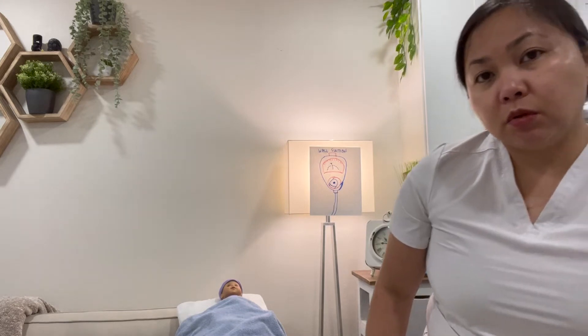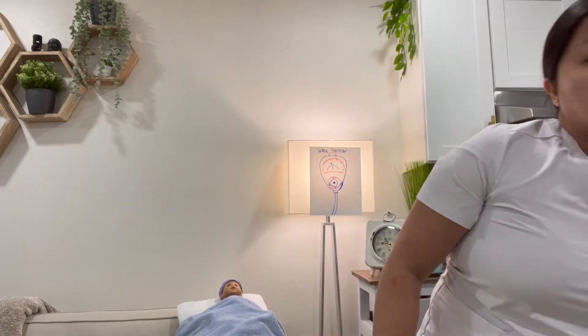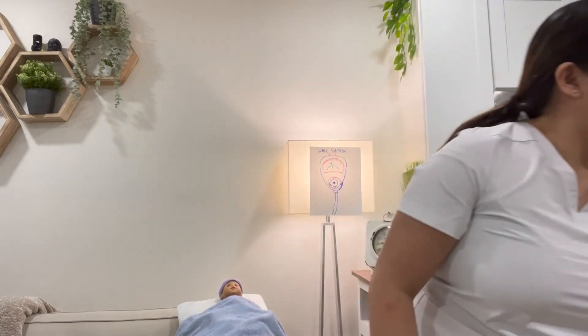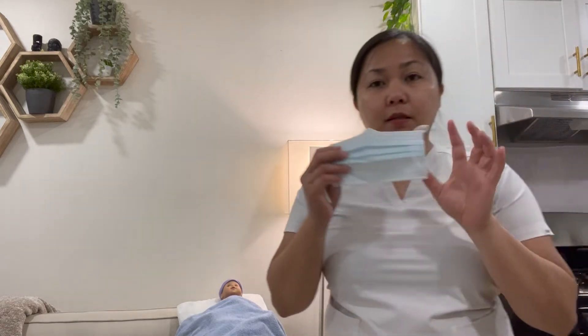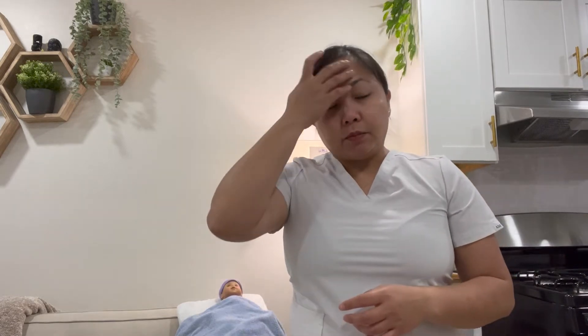You would also like to get your goggles, a disposable towel or pad, sterile water, water-soluble lubricant, your mask, appropriate PPE if needed, and disposable gloves.